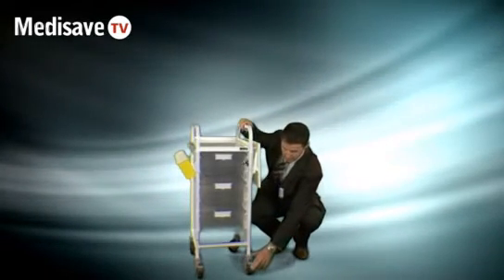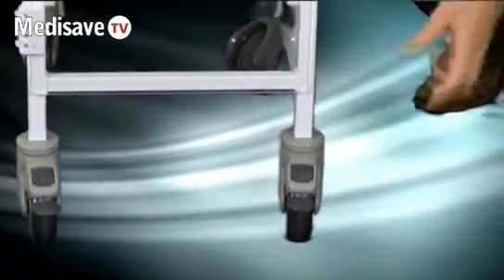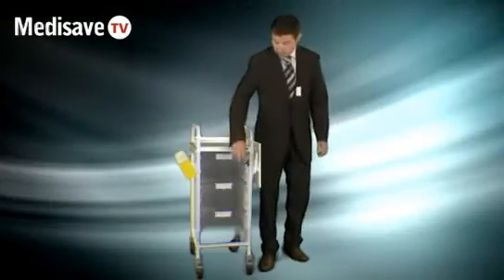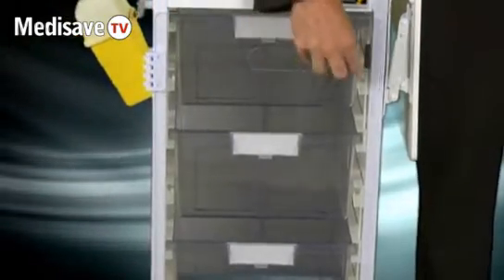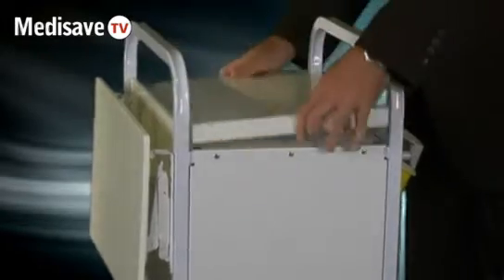You can see the casters at the bottom here — you just push down to lock and release to unlock. This trolley comes complete with an optional locking front door. When you buy a locking front door, it isn't only a plastic front door; you actually also get a solid back and a solid base, which makes the trolley essentially a tamper-proof trolley.